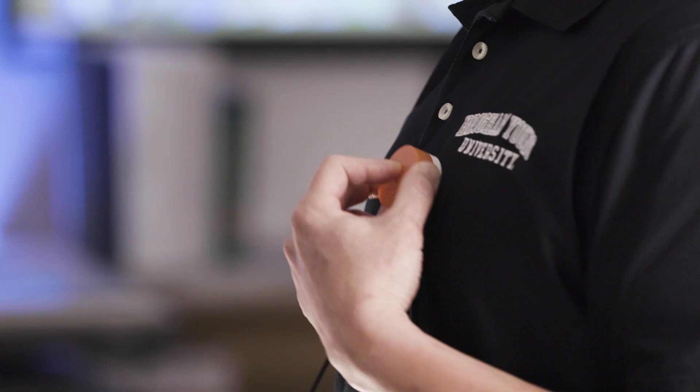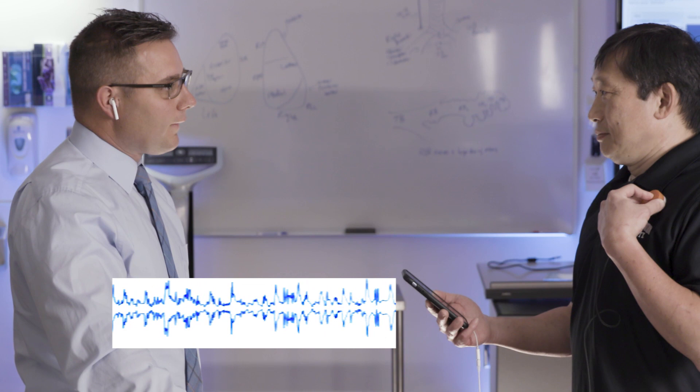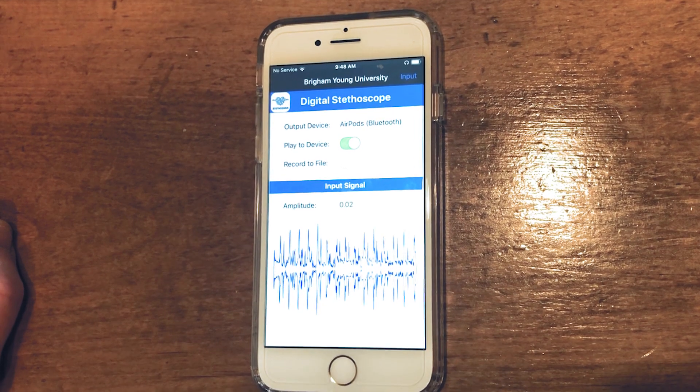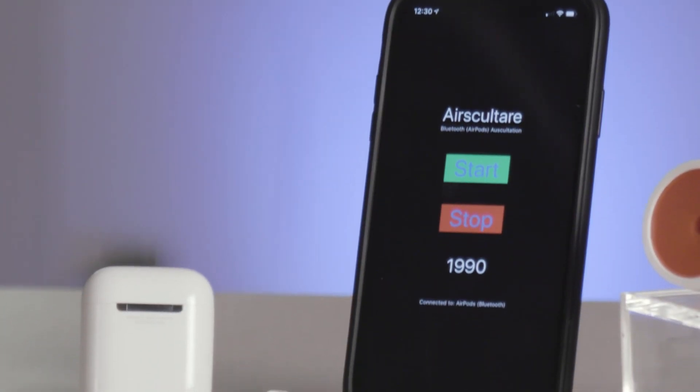So you can be sitting 10, 15 feet away talking to your patient who has this. So you just tell me where to put it. Right there. I can hear that perfectly. That's going to be awesome. This digital stethoscope can become a tool for patients to be diagnosed without being in proximity with the physician.